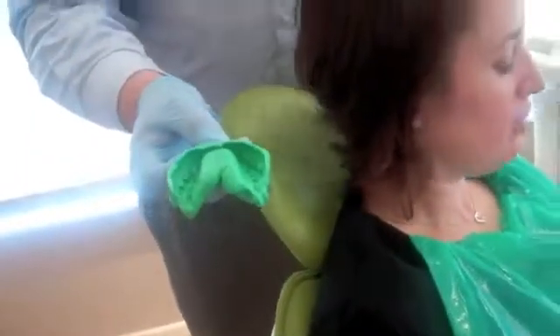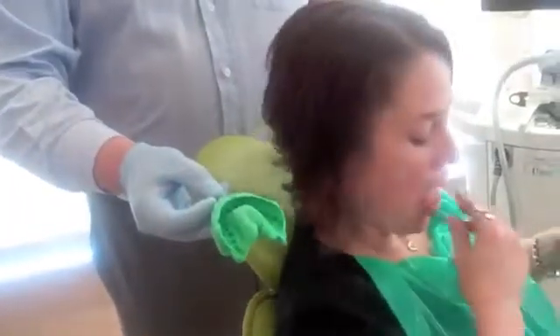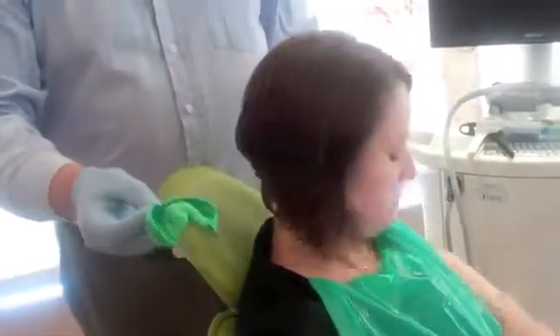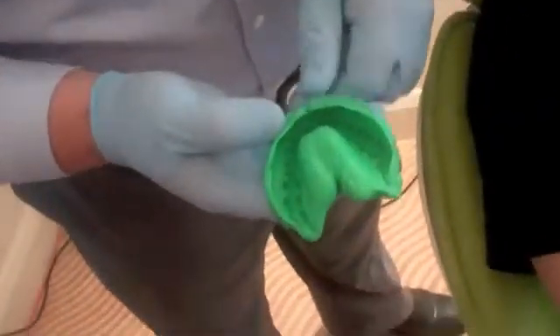It tastes foul. And that's one of the flavoured, thoroughly flavoured, pleasant ones. So I think you've got a reasonable idea now of what's involved with conventional impressions. If you zoom in there as well, we could probably illustrate some of the problems with conventional impressions too.